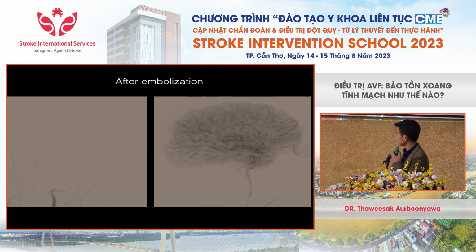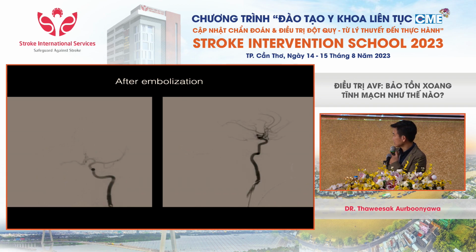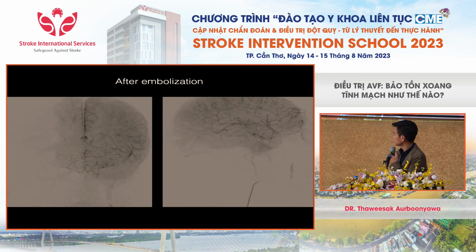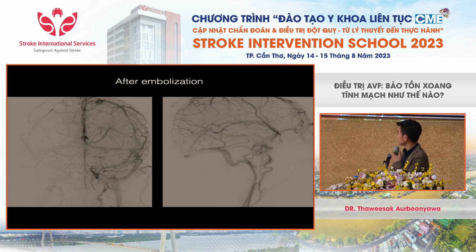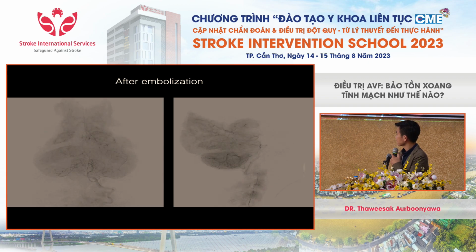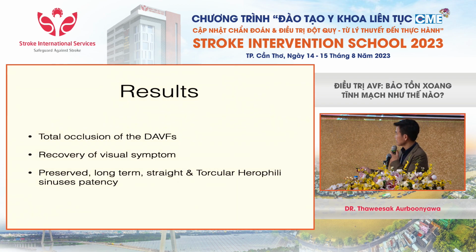Sorry, the video doesn't work. But you can see the drainage of the brain. The straight sinus was preserved. Here, the transverse sinus was preserved. So we have good long-term follow-up, and the visual symptoms are getting better.